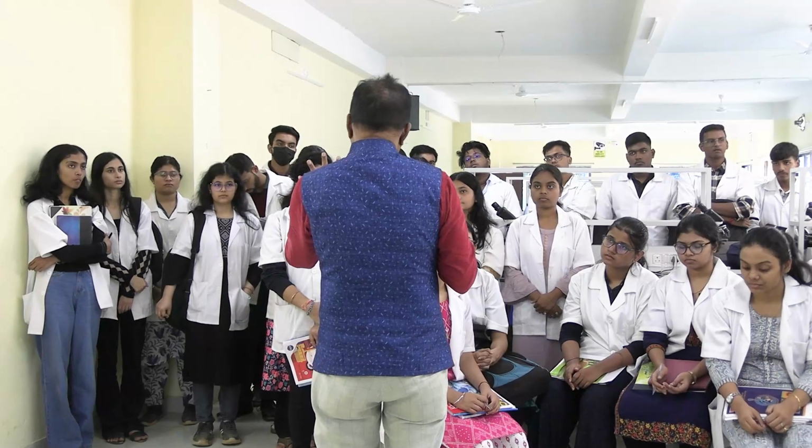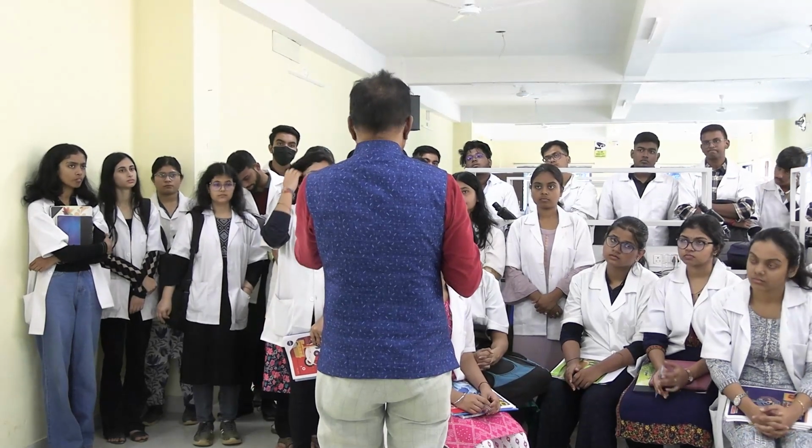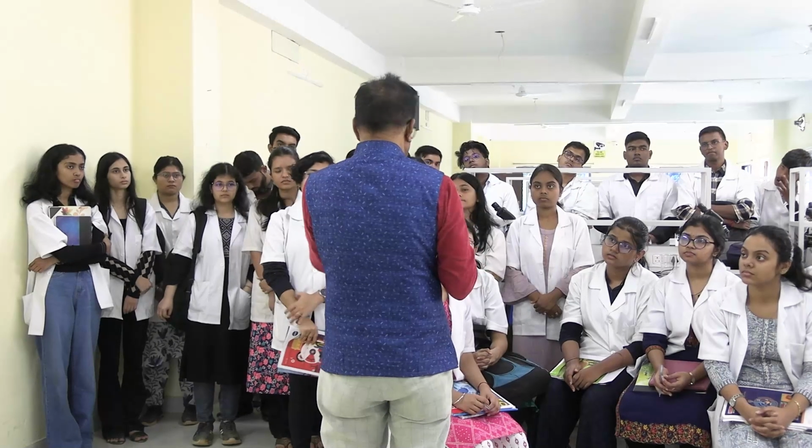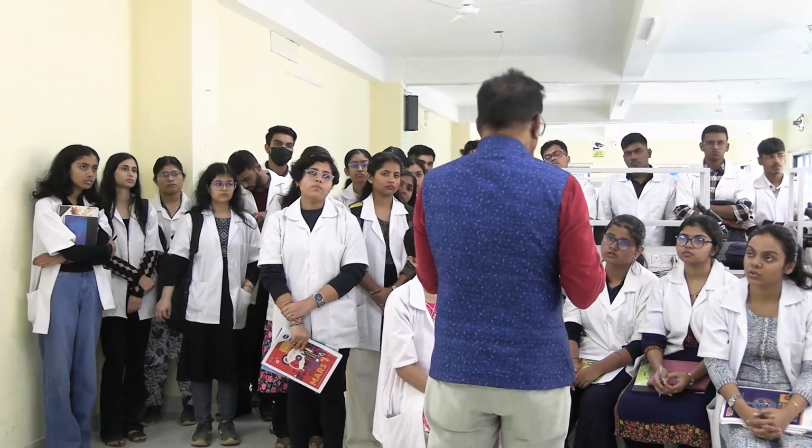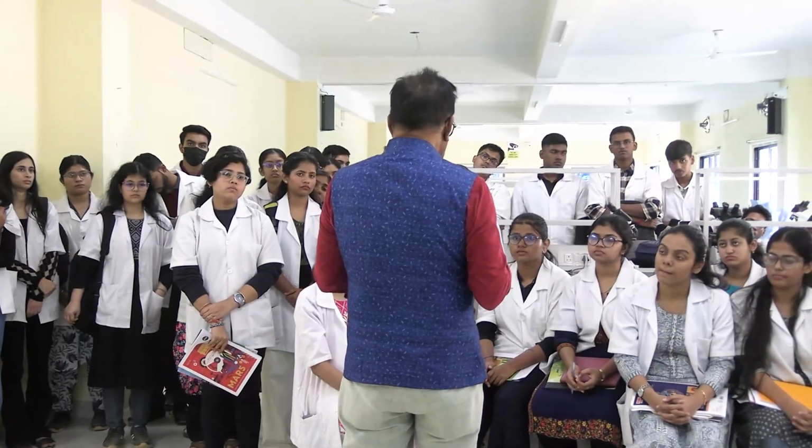There are different kinds of neutrophils. Not kinds. We have differentiated them, classified them according to the number of lobes. Okay, let's see.